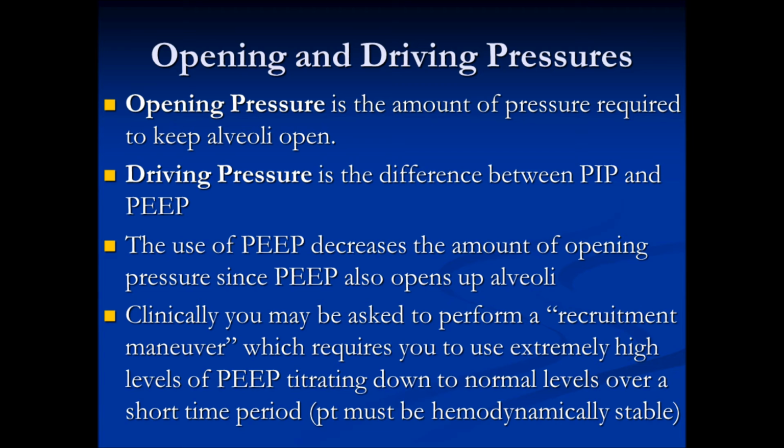Okay, opening and driving pressures are important to know with neonates because it really affects how well you're able to ventilate the baby. Your opening pressure is the amount of pressure required to keep the alveoli open at all times so that it doesn't collapse and you get atelectasis. Driving pressure, of course, is the difference between where you're starting from and where you're going.